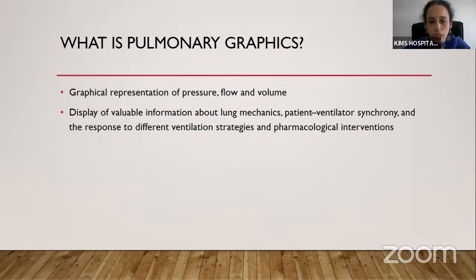So it displays valuable information about the lung mechanics and patient ventilator synchrony, whether there is synchrony, and the response to different ventilation strategies which we are applying to the baby, and pharmacological interventions like giving surfactant, giving bronchodilator nebulizations. The changes can be seen in the pulmonary graphics.